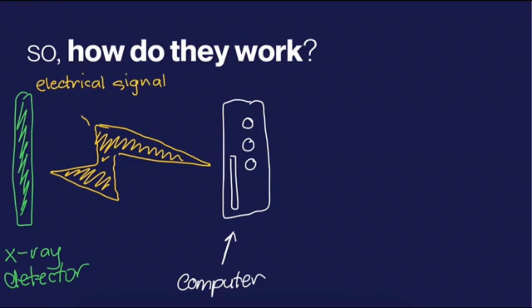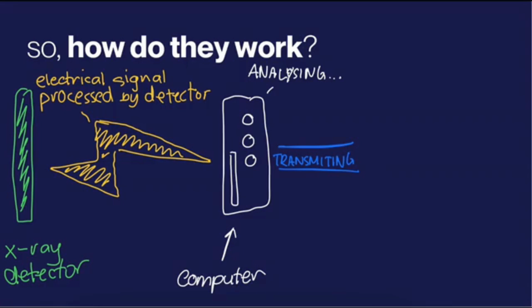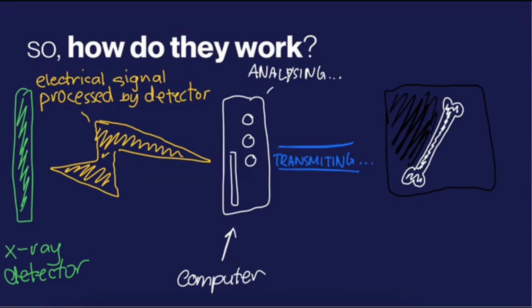These cross-sectional slices of the patient are called tomographic images, which is where the name computed tomography is derived from. When these slices are digitally stacked on top of one another, it can create a 3D image many times clearer than a typical X-ray, thanks to the higher number of angles it is captured from.